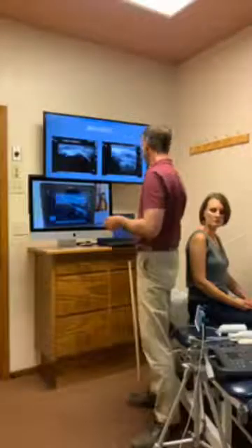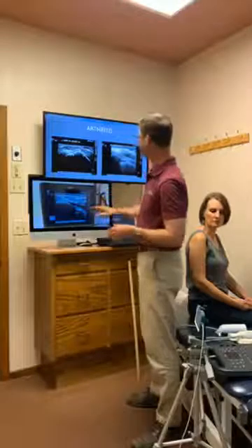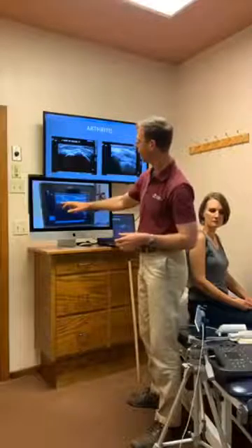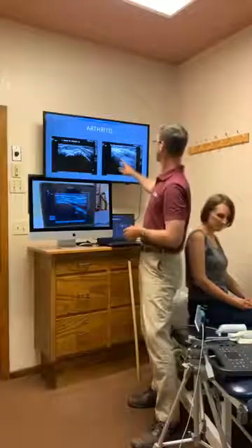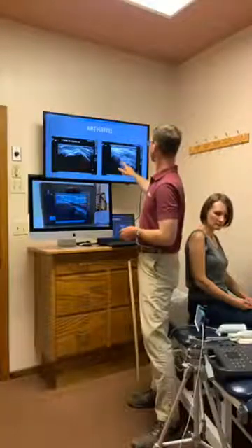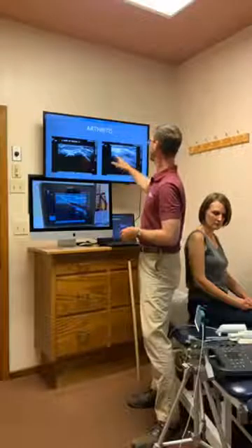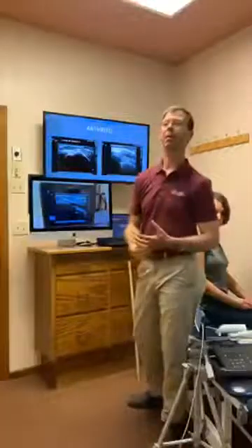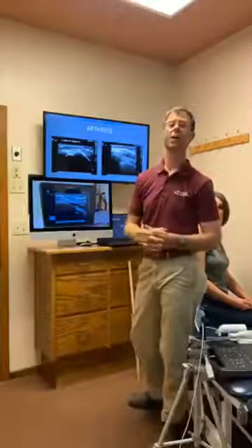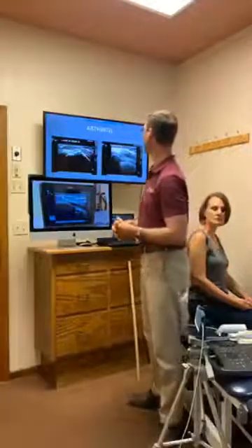So now, in this view, you can see how nice that bone is, the head of the bone here. Now over here, in the same view, on this particular individual, well, here's the bone. All right, we have arthritic change. That bone has lost its normal appearance. It's got a lot of cortical changes, a lot of change. So it's suggestive of arthritic changes.